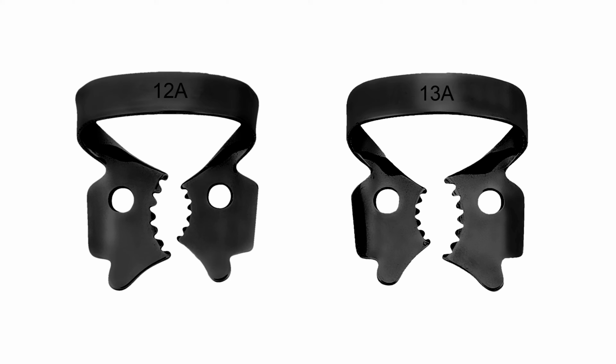The next tip is about using the right clamp. One of the clamps that was introduced to me this year that really changed the way that I clamp molars is the 12A and the 13A clamps. These clamps have tiger teeth on them, so you get more contact points with the teeth.